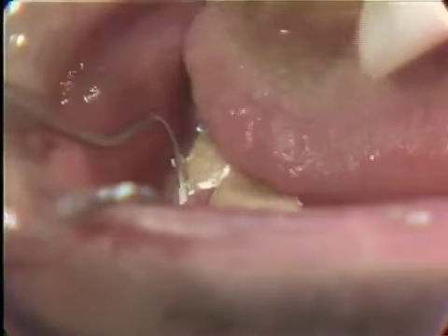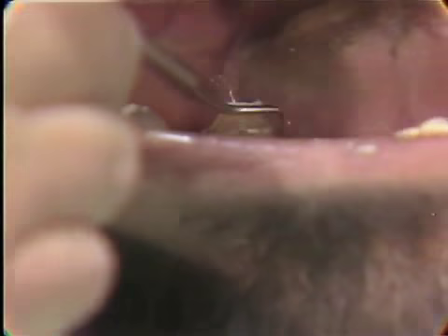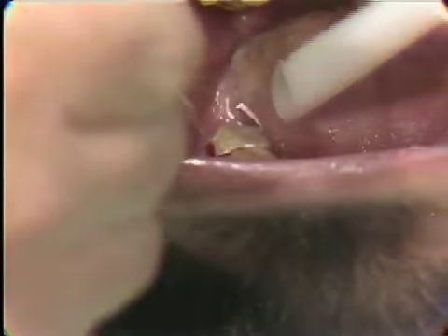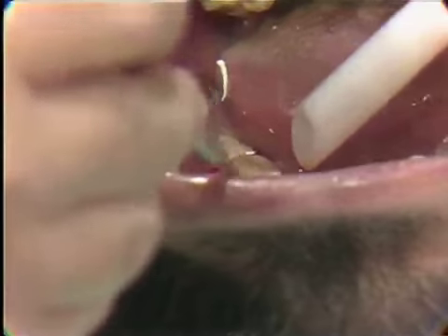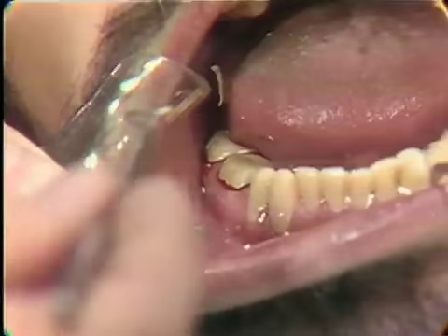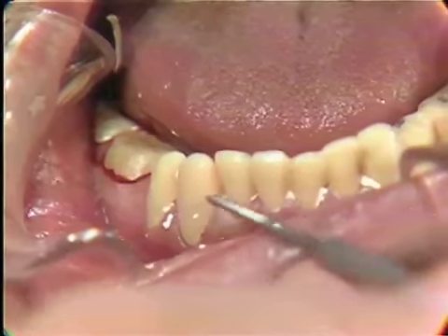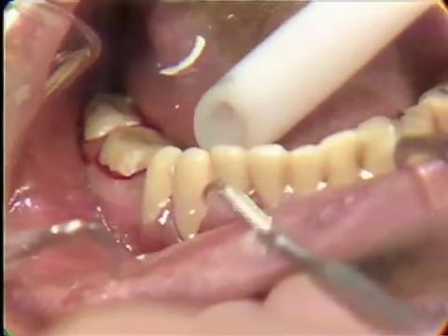It's very important to get rid of the cement. Now this can be a very painful procedure. It should be done very, very carefully. As you can see, these tissues are still not back to normal from our impression procedure. There's still more hemorrhage than you would normally have.